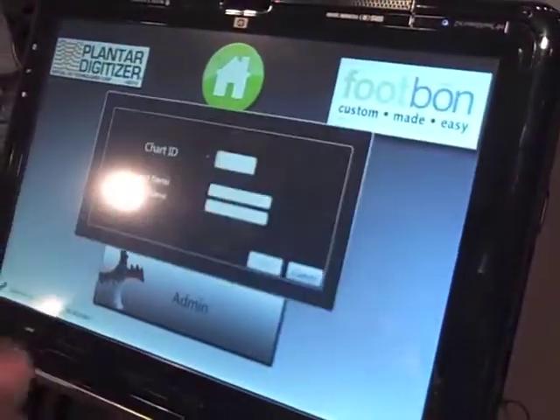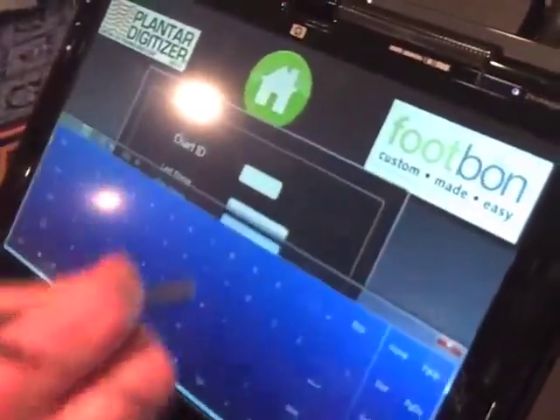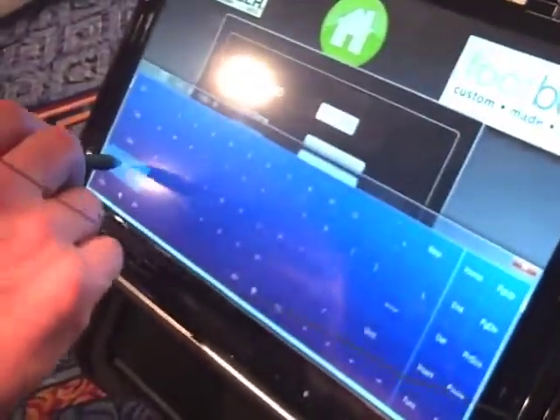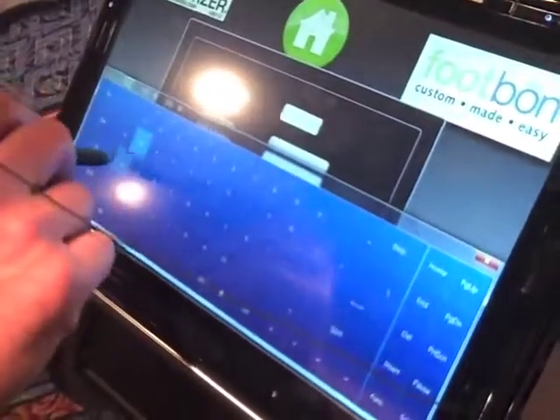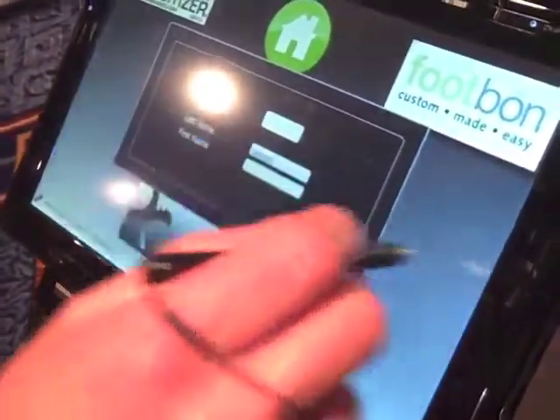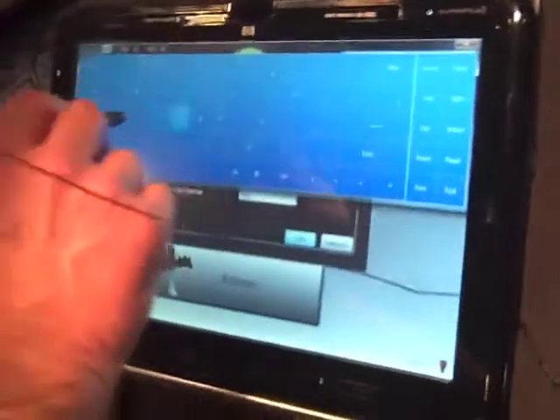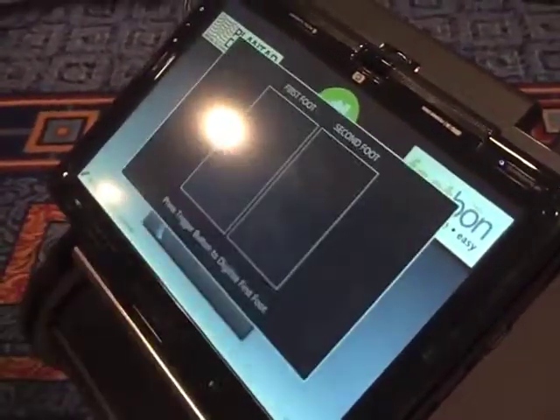The first thing I'm going to do is enter a new patient's name. We do that with our touch screen — we just type in the patient's name directly on the keypad. And now we're ready to digitize this patient.